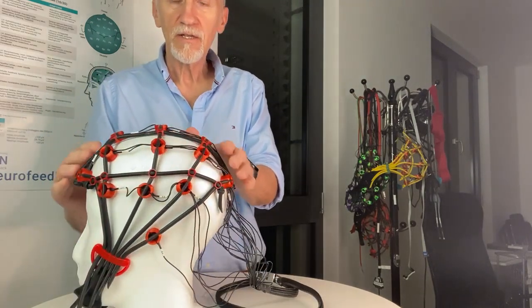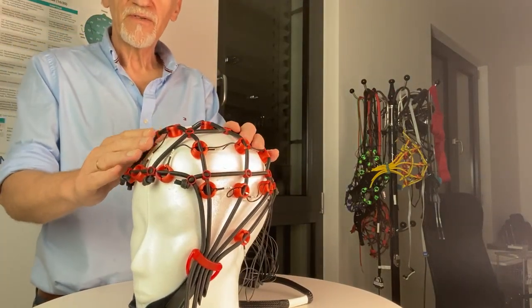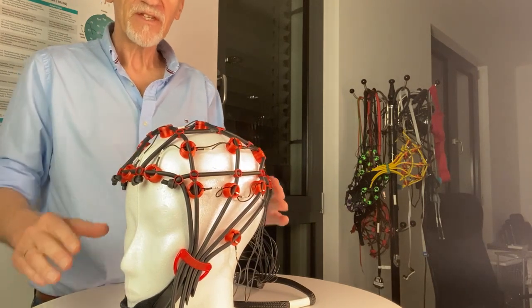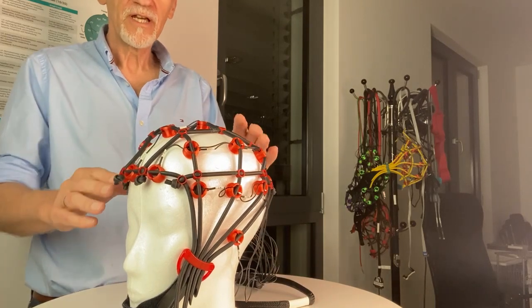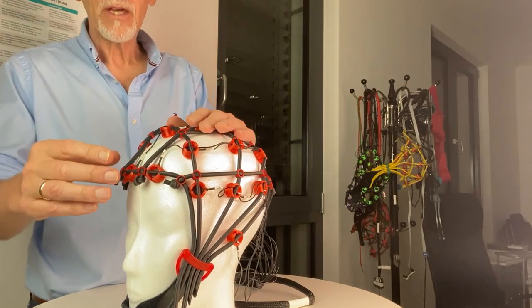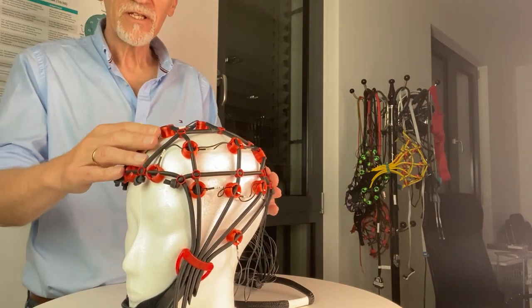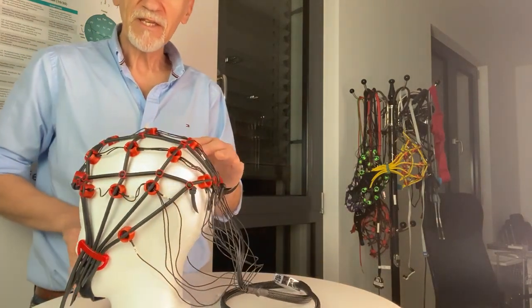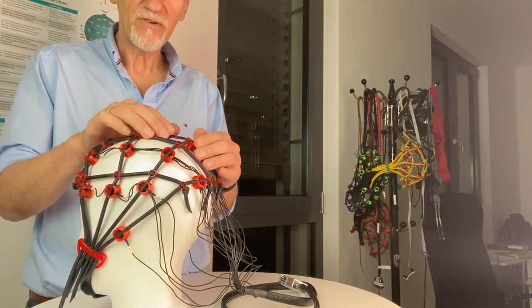The 10-20 system is a rule, and you can use this rule and transfer it to the cap. First of all, you need to know that many electrode positions are interconnected — you can draw a line between them.